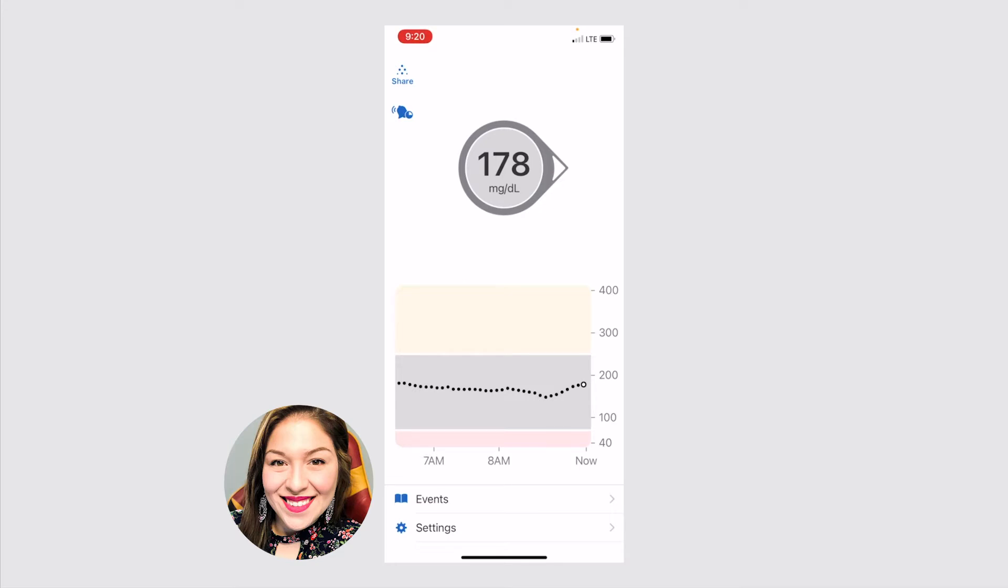This is what your trend is. If it's just pointing straight, that means your sugar levels are pretty steady. They're just going straight. As you can see in the graph, it's a somewhat straight line. But the arrow will also sometimes point up to show that your sugars are rising, or it'll point down to show that your sugars are dropping. This is a really good quick indicator of what your blood sugar levels are doing.